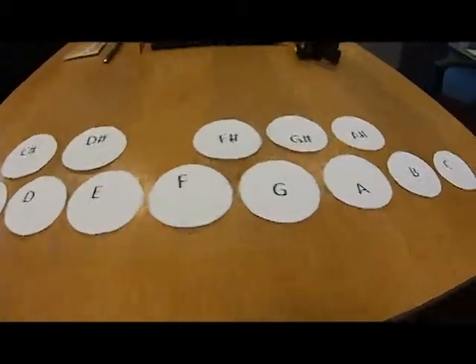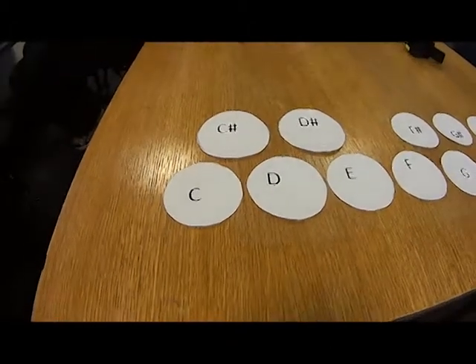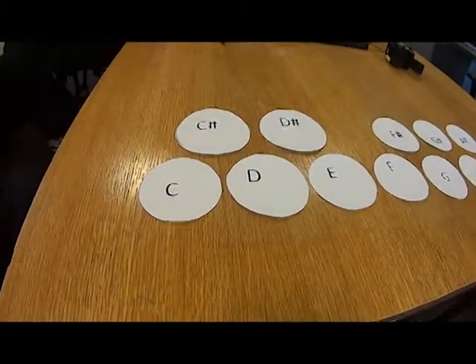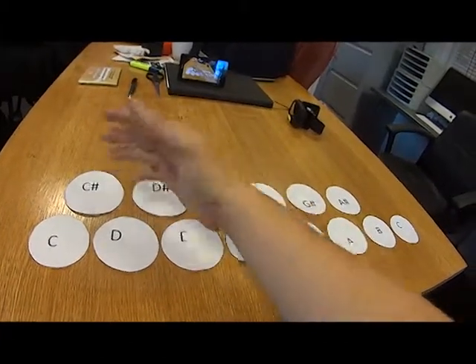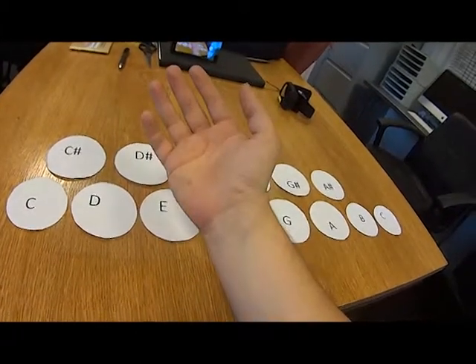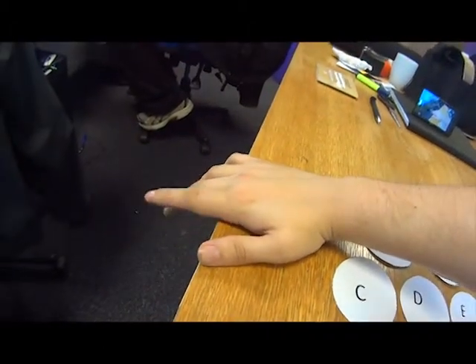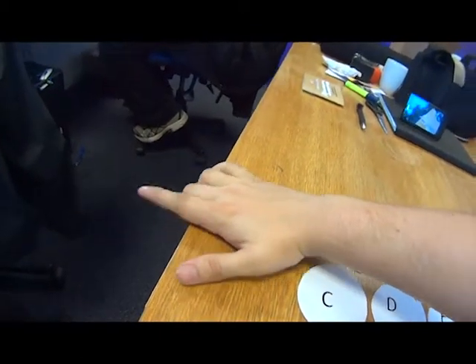Okay, so this is a sort of mock-up of the design for my musical instrument for people with stroke rehabilitation. It's going off of the process of someone who is looking to exercise their wrist in a sort of motion like that. I decided to go for wrist instead of fingers because there's not a lot of finger movements I can do. The common ones are putting your hand on the edge of the table and doing little bits, so it doesn't really work.